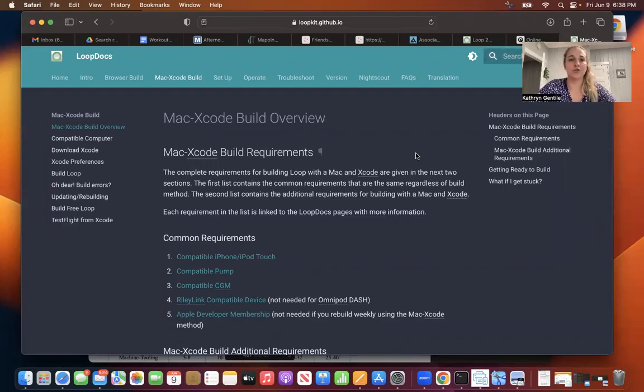I am here to show you how to do a Mac build for DIY Loop. Now, I am assuming in this video that you have done this before. So if you haven't, you definitely want to read over everything within Loop Docs or Loop and Learn. For the purpose of this video, I'm in Loop Docs, but you can also go to Loop and Learn to follow those instructions for how to do the build for both browser and Mac.